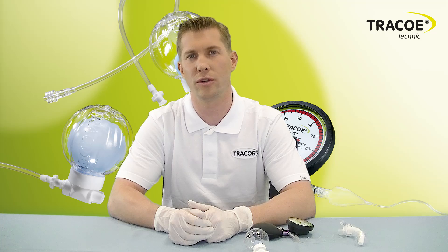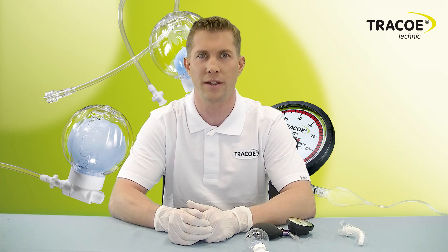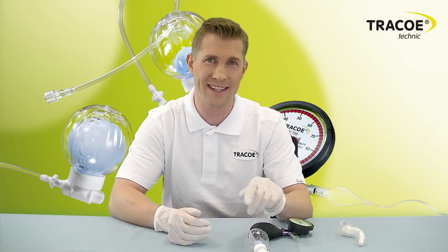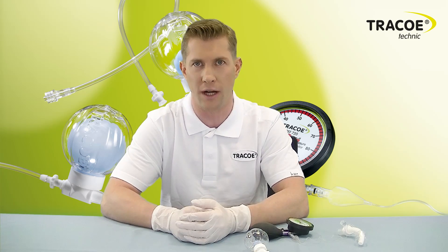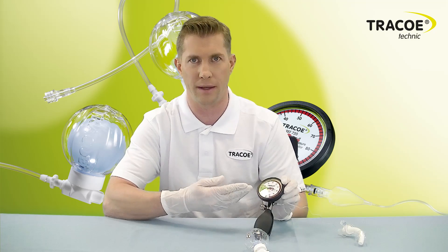Hello, today we're going to introduce you to the use and function of the TracoSmart Cuff Manager. The TracoSmart Cuff Manager is designed to keep the pressure of all high-volume low-pressure cuffs of tracheostomy tubes and endotracheal tubes at the recommended level between 20 and 30 millibars.